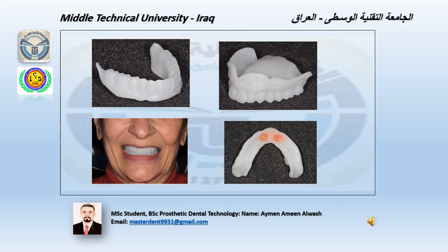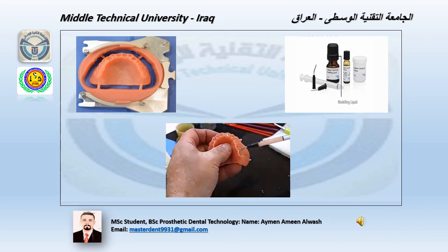The patient wears the complete denture template for about 2 to 4 days in his house to check the mastication, phonation and retention of the complete denture. After complete checking of the complete denture by the patient, now we are ready for milling the final denture base by using a pink blank of PMMA disc and milling the dental arch.